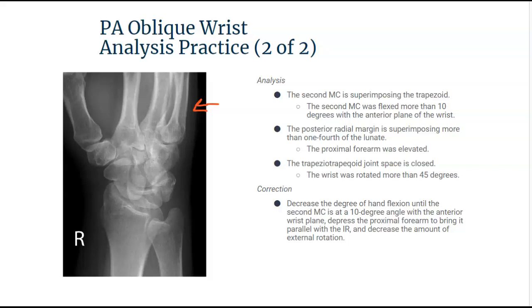Also, the posterior radial margin is superimposing more than one-fourth of the lunate. You can see it's superimposing more than one-fourth of the lunate, which means that the proximal forearm is elevated. We need to decrease the hand flexion, depress that proximal forearm, and decrease that amount of external rotation so that the wrist is in that 45-degree obliquity that we need.